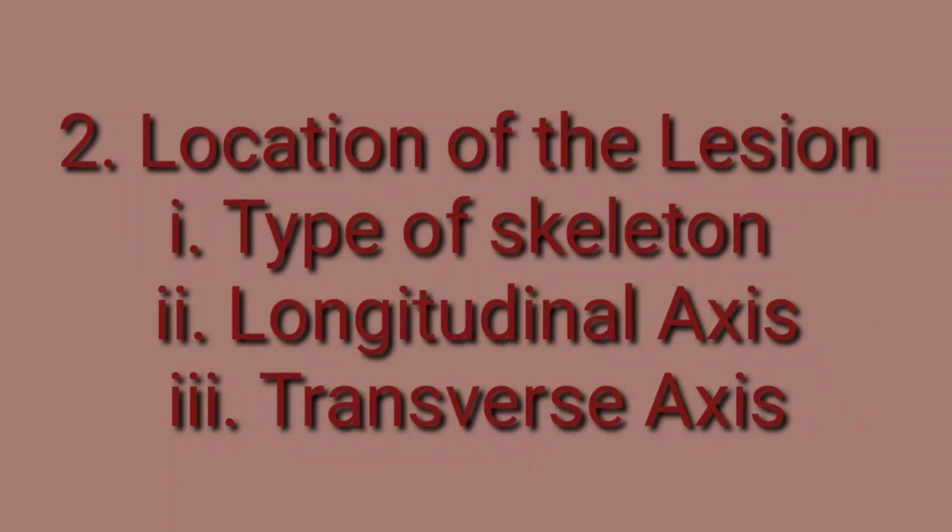Look for the longitudinal axis, whether the epiphysis is involved, or the metaphysis or the diaphysis. It may be metaphyseal-diaphyseal, for example enchondromas happen to be metaphyseal-diaphyseal. Besides this, always look for the transverse axis, whether it is central, eccentric or cortical. For example, osteoid osteoma and osteoblastoma happen to be cortical. Fibrous dysplasia or a simple bone cyst can be central, while aneurysmal bone cysts are usually eccentric.